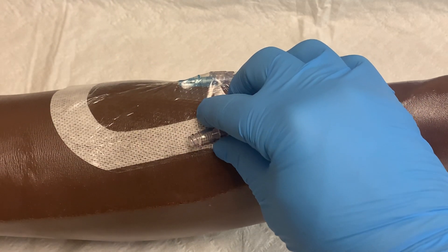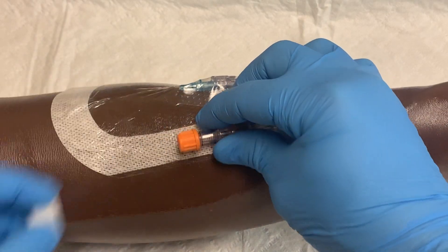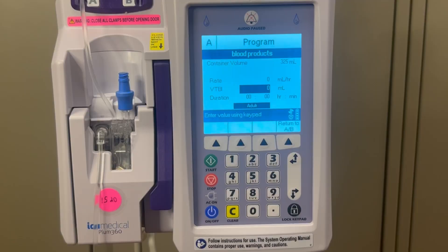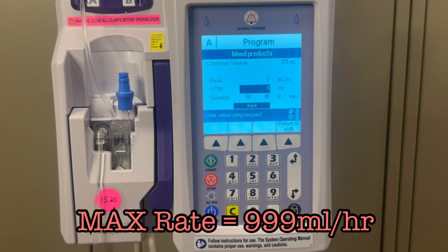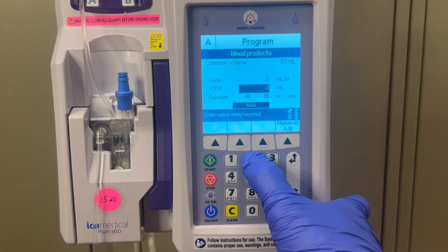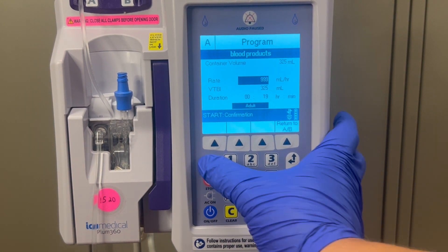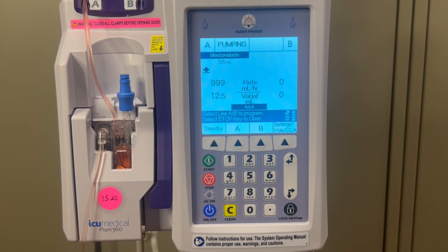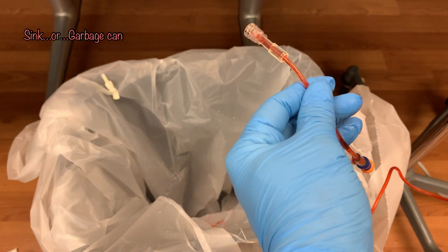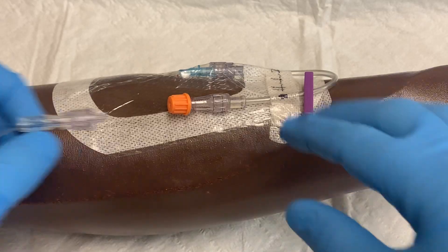Now you will need to prime the entire line with blood. Make sure the IV is disconnected from the patient and cover the IV with a swab cap. Then return to the pump — you can use the pump to quickly prime the line by having the detached IV line run at the maximum rate of 999 milliliters per hour. First enter the volume to be infused, which is the same as the volume of the blood bag. Then for the rate, enter 999 and start. Drain the fluid into a sink as you wait for the blood to reach the end of the tubing, and as soon as the fluid at the end is colored slightly red, stop the infusion pump and attach the IV tubing to the patient's IV.